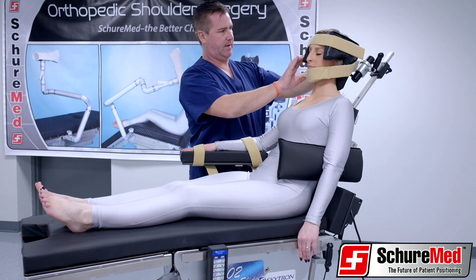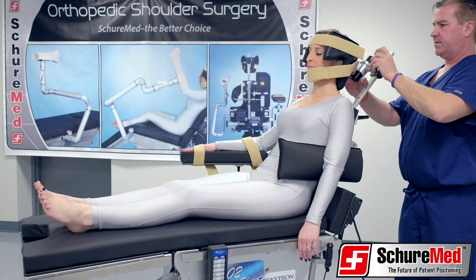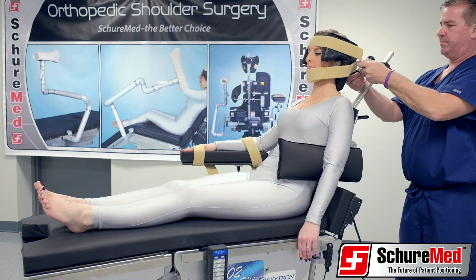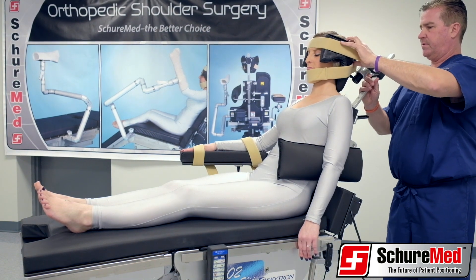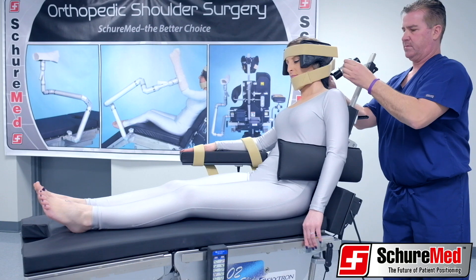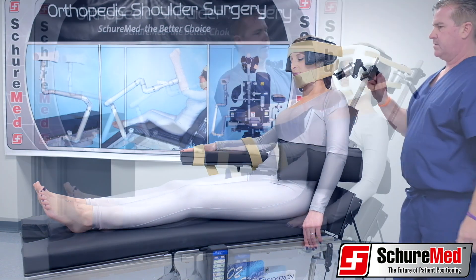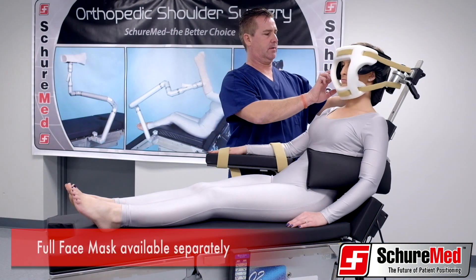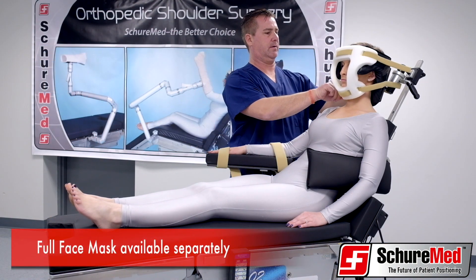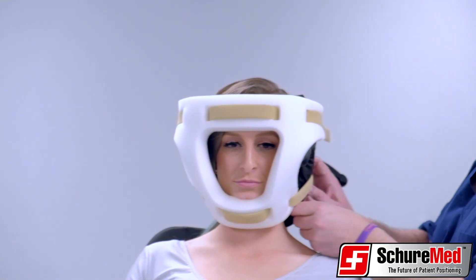To make adjustments, loosen the ball joint locking lever and position the support post all the way down and centered in relation to the shoulder chair. Tighten the locking lever when the support post is in the desired position. Adjust the headpiece up or down on the support post to accommodate the height of the patient. When the headrest is in the desired position, turn the lever either clockwise or counter-clockwise to lock the double-bore joint.